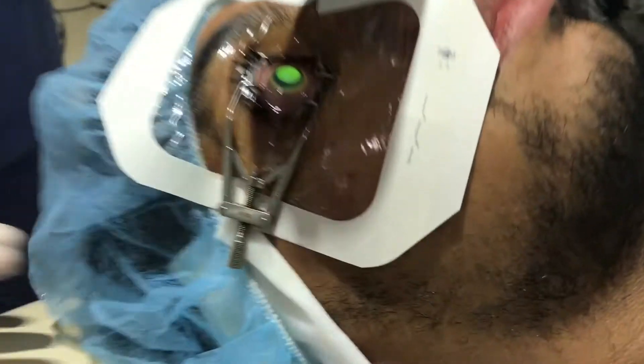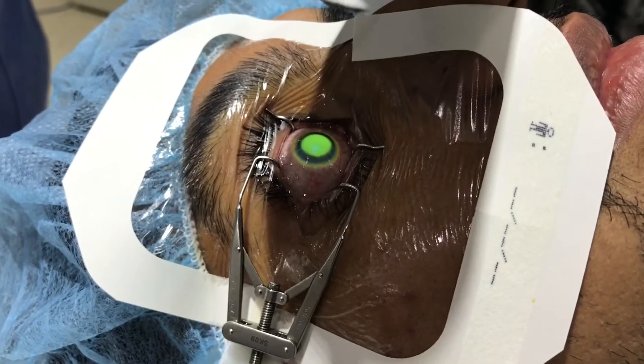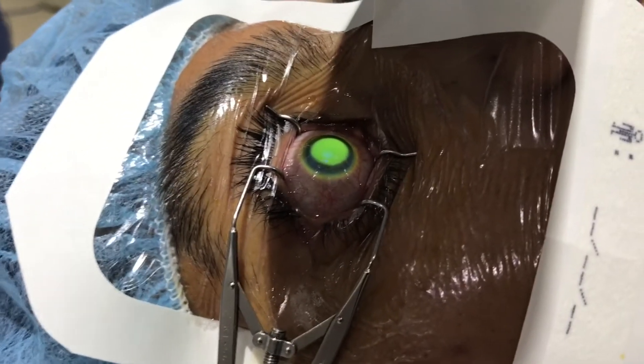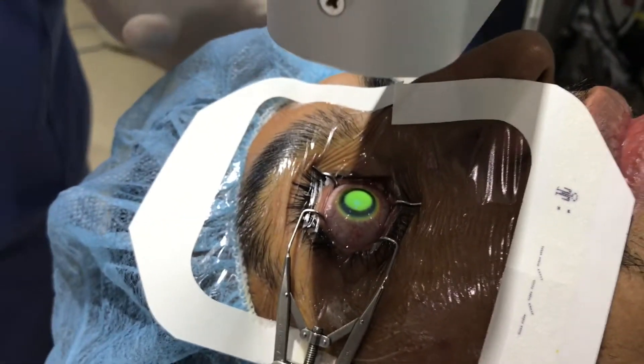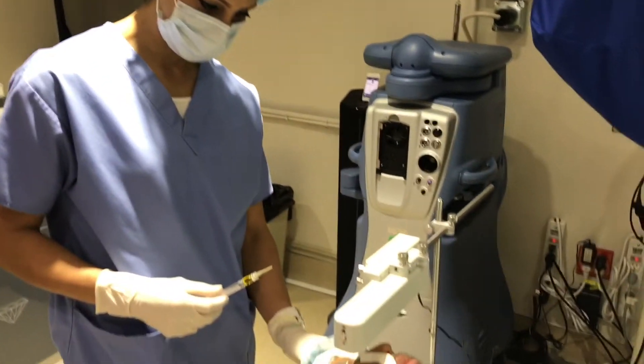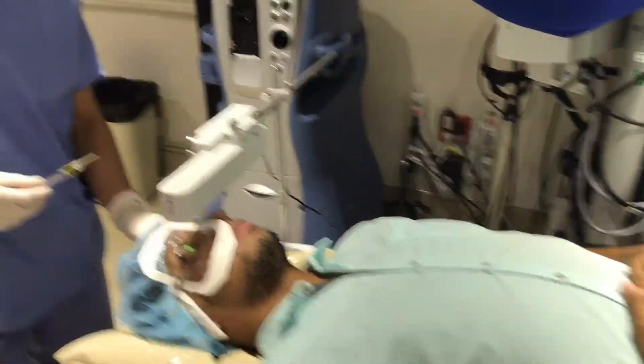So guys, we're doing collagen crosslinking on this young man who's had a condition called keratoconus. As you can see, the eye is full of riboflavin and is being zapped by UV light. It's sort of like sitting in a tanning salon and having your cornea just flatten out.